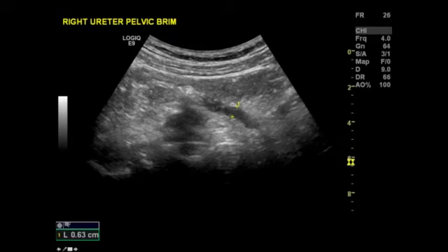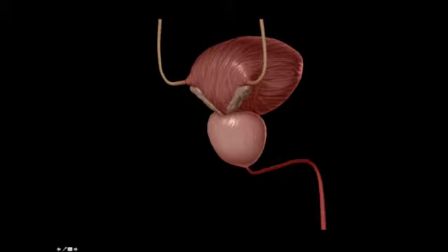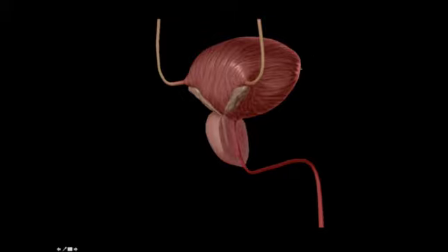So how to search for those distal ureters. When we think about the ureters, they come in posteriorly on either side of the bladder at about the halfway zone. You see these seminal vesicles in the male and a prostate underneath it, and the prostatic urethra comes out here. And we're going to look from the front. Here you can see the prostatic urethra coming down.